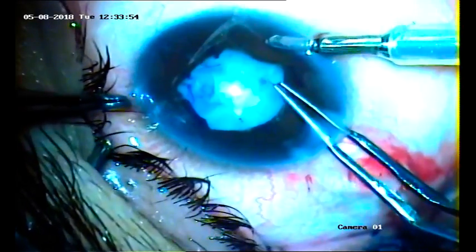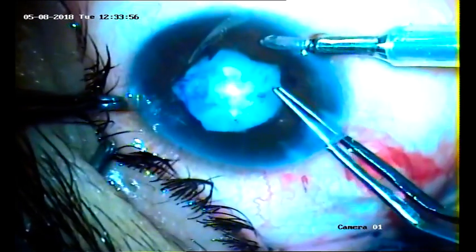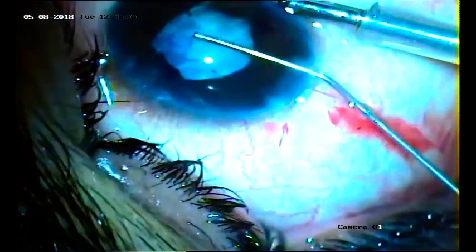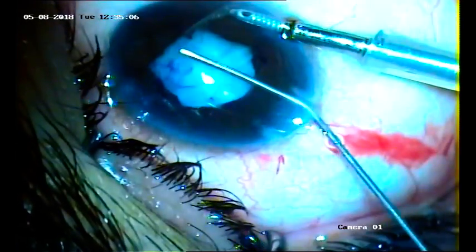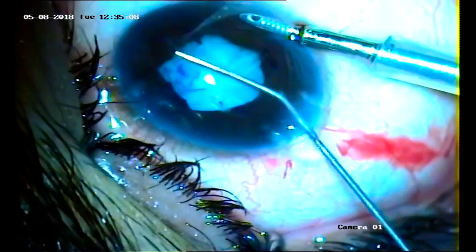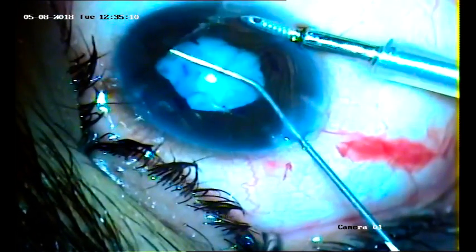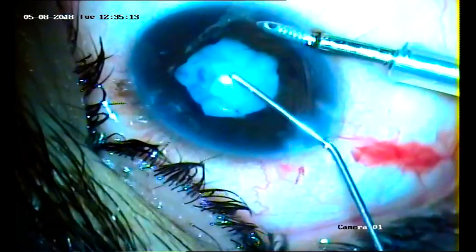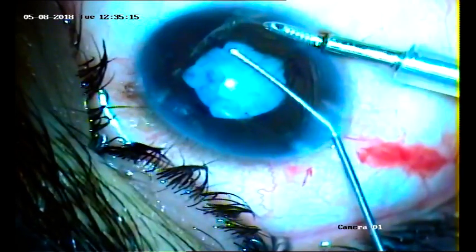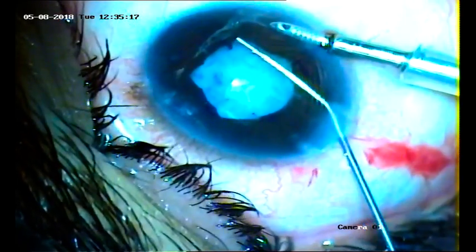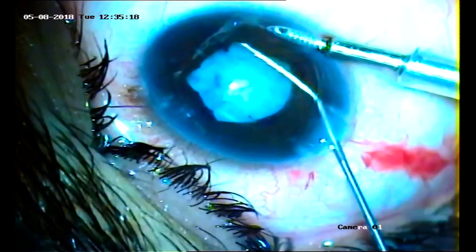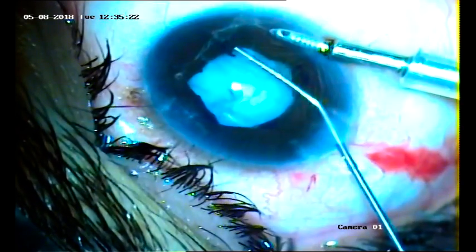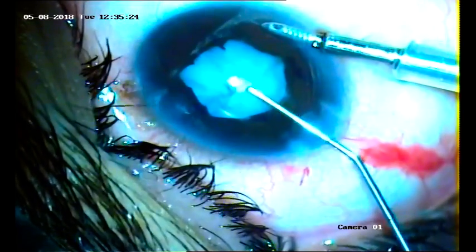Now we are doing the capsulorrhexis. As the capsule is very fragile — and at places it is thick and calcified — in such cases we have to do things very delicately. We have to respect the iris tissue as much as possible, in order to reduce postoperative inflammation, adhesion, synechiae, glaucoma, and other complications.